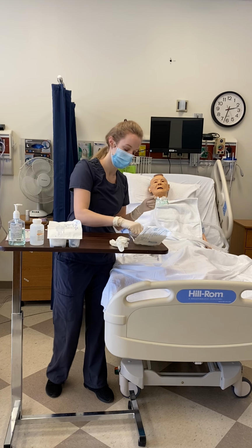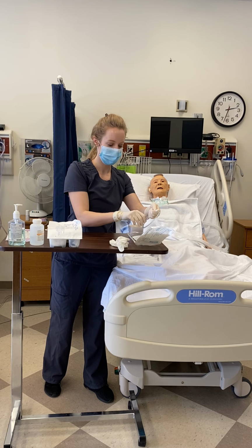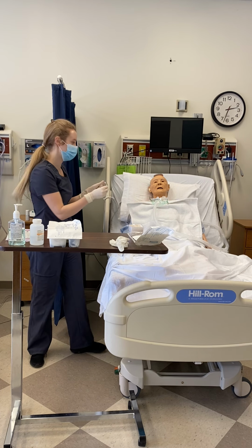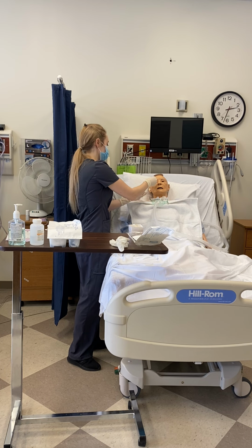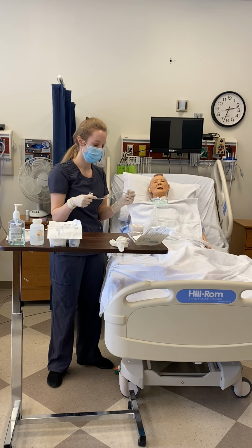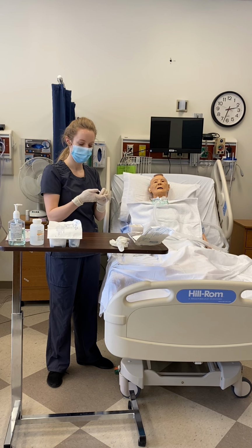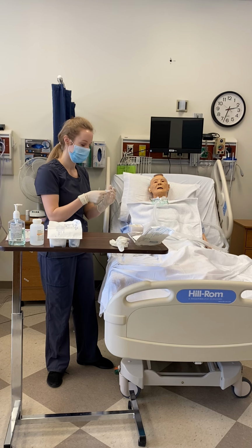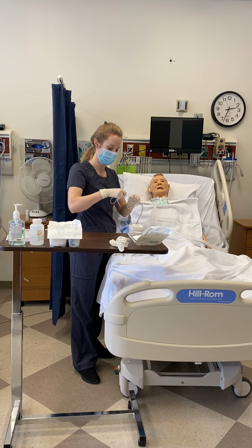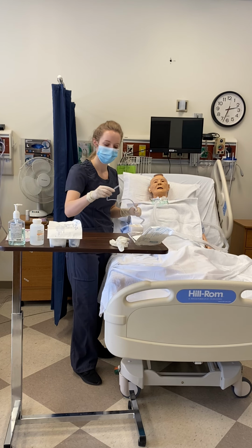Okay, now that I'm sterile, I take my suction catheter and I will wind it here. I need to measure, so I'm going to measure from the nose to the ear to the tip of the xiphoid process for my nasopharyngeal suctioning. At this point, I coil it around my dominant hand, which will remain sterile, and I will hook it up, breaking sterility on my non-dominant hand here, and occlude it with my thumb to ensure that it's working.